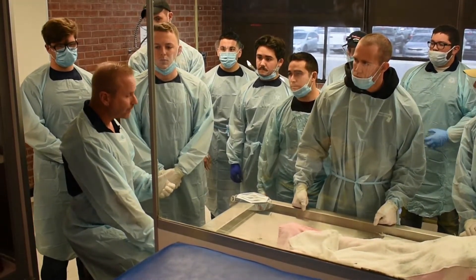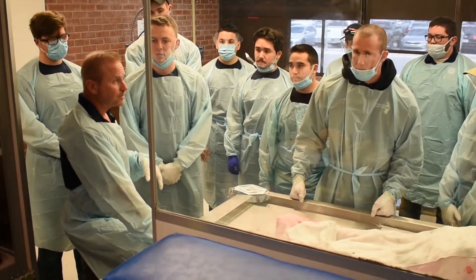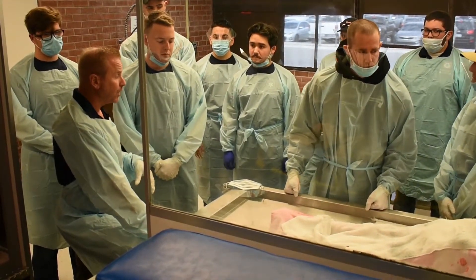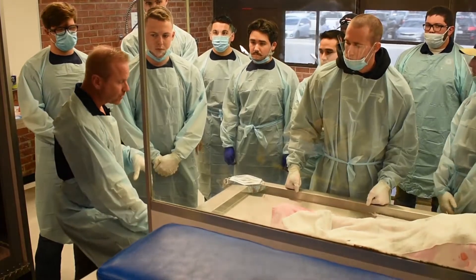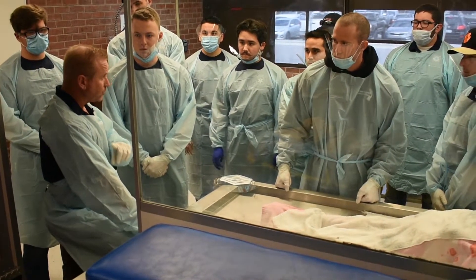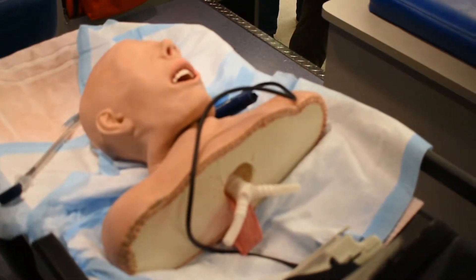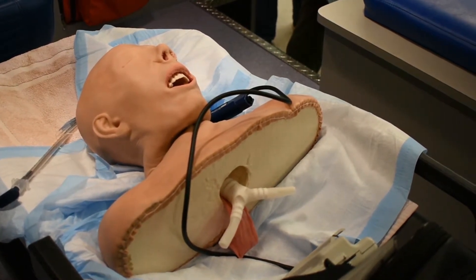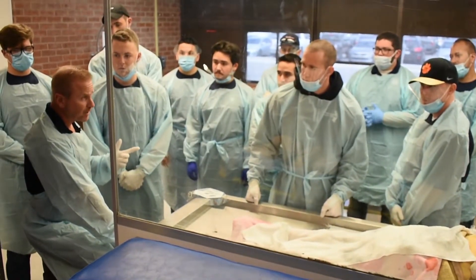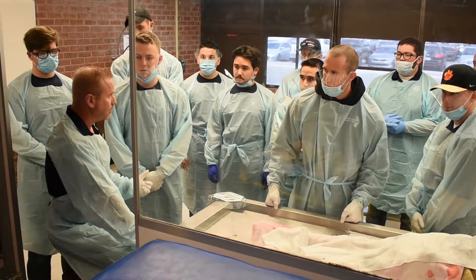There is a method to my madness about teaching difficult airway. Practice with all the different blades. These mannequins are pretty real — almost as real as you're going to get without being in an OR or with a real patient. With the GlideScope Ranger, you have to use a rigid stylet. You'll use the GlideScope Ranger at St. Mary's, St. Joe's, and Carondale. When we get to that station we'll show you how that works. I actually carry a rigid stylet in my truck and use it every single time for adult patients.